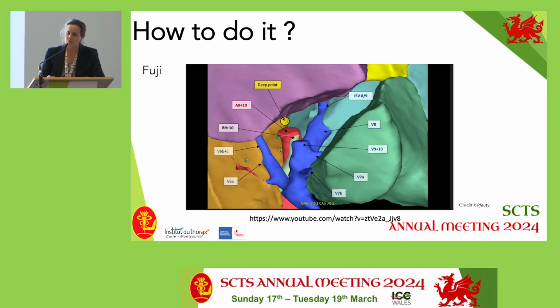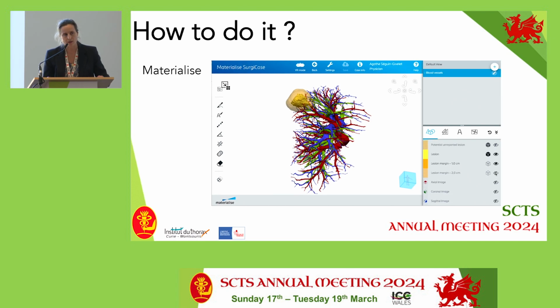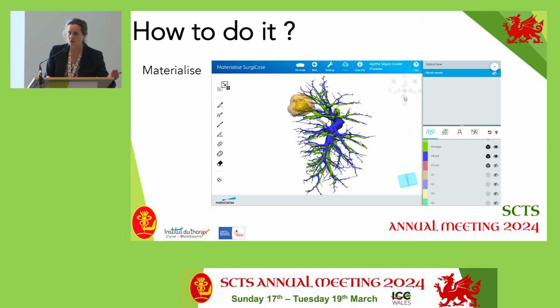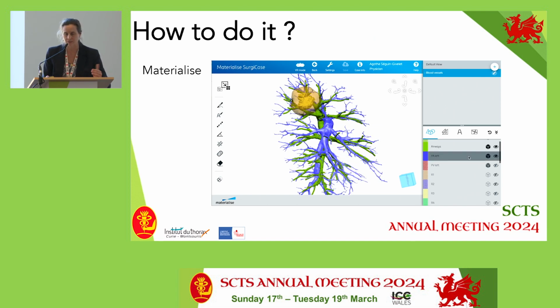Fuji systems, that picture coming from Karel Feuty, a good friend of mine in France, and he used this system a lot and worked a lot on doing videos, trying to do what he called the fly plan, like if you are on a plane, preparing his segmental resection. Materialize, we tested it, and in my personal view, I hope Materialize is not there, it's not the best one. But you can navigate inside the 3D reconstruction, put the artery, the vessels, take them off, try to simulate your resection, so it's just a matter of time.